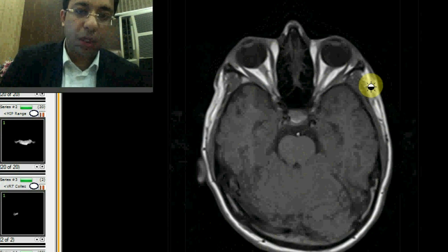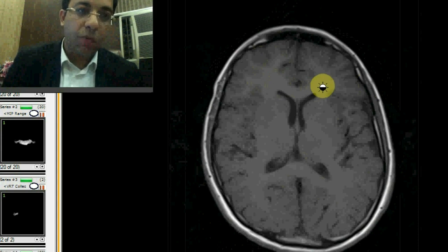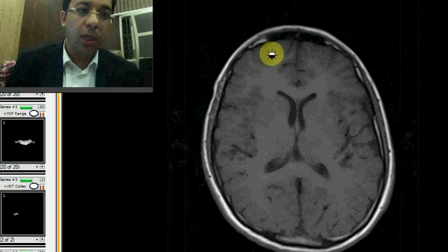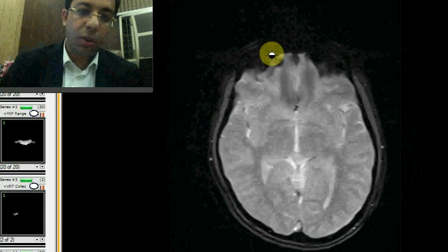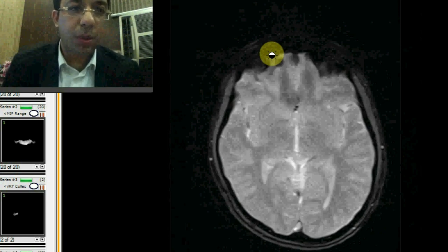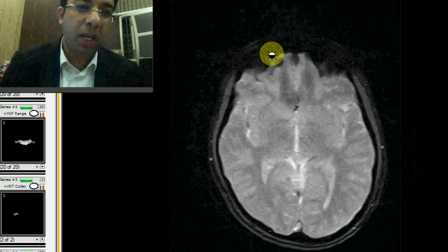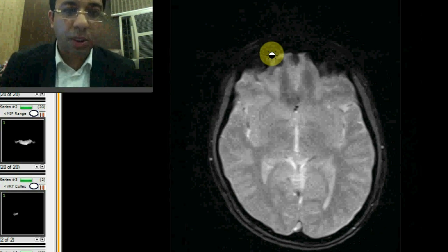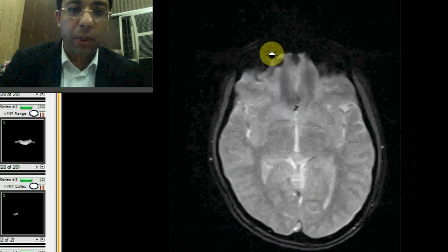On a T1 weighted image, white matter appears white and gray matter appears gray — the reverse of T2. FLAIR is a T2 weighted image with CSF signal suppressed. Now, the next sequence is a gradient echo image. T1 and T2 are spin echo images, while this is a gradient echo sequence. We do gradient echo particularly to look for blood products or calcium, which show signal suppression — hemosiderin or calcific lesions are better appreciated on gradient echo.